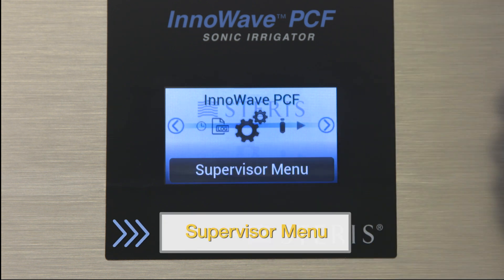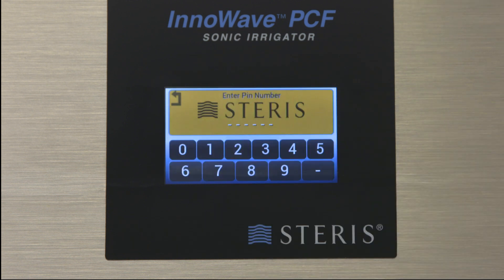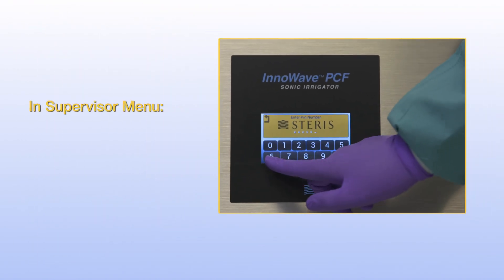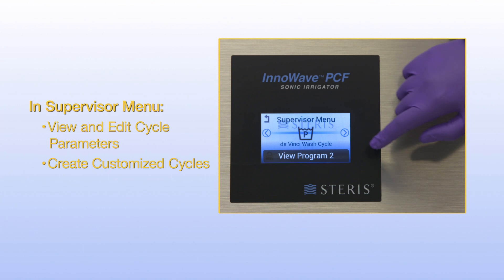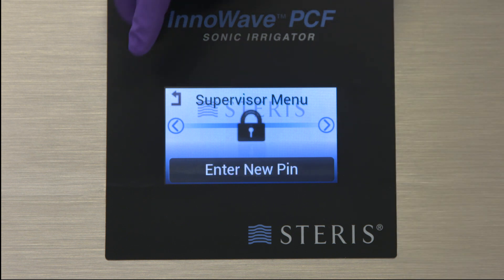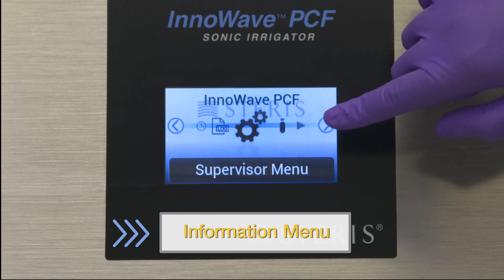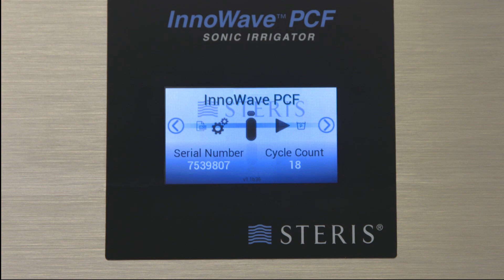The supervisor menu is password protected and uses a six-digit code to access. Access the supervisor menu to view and edit cycle parameters, create customized cycles, or change the password. Use the information menu to find basic information about your unit, including the serial number, cycle count, and software version.